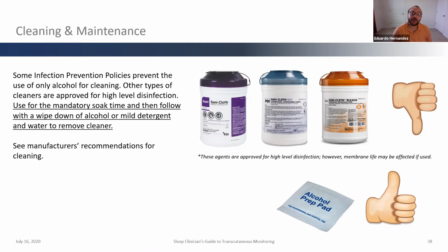Now, talking about this method of cleaning, we are currently still in a pandemic. It's important to know that even though these transcutaneous monitors are not disposable, there are ways that we can disinfect and reduce possible cross-contaminations and infections. It's usually recommended for the life of the membrane itself. And these monitors are very smart, because they'll tell you when you need to change the sensor membrane or when one is recommended to be changed.